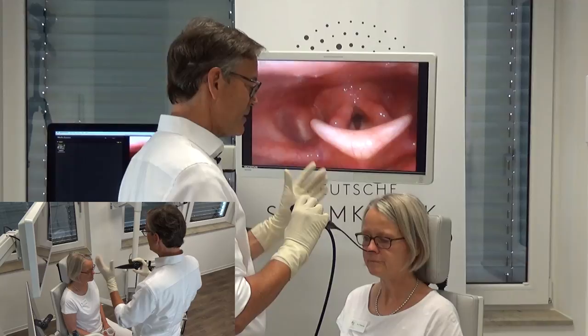I estimated, because I've done this a couple of times with her, that she can probably sustain the inspiratory movement for a couple of seconds.